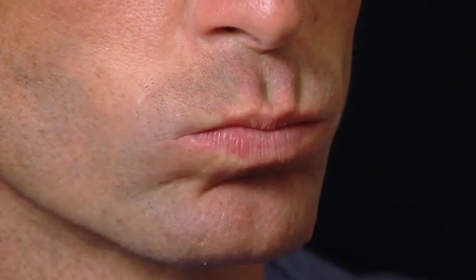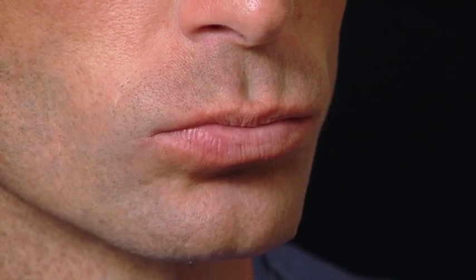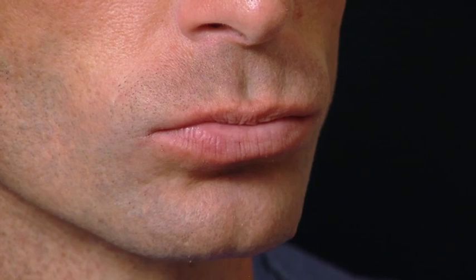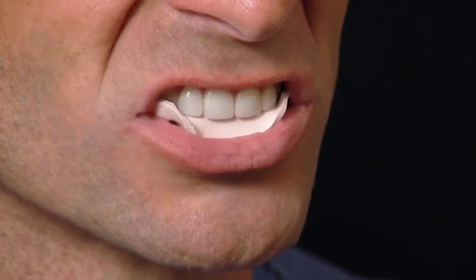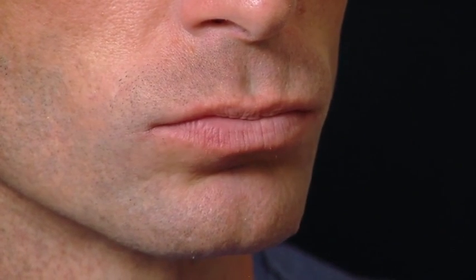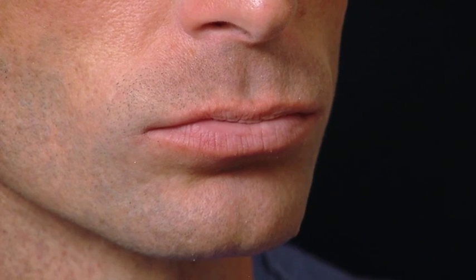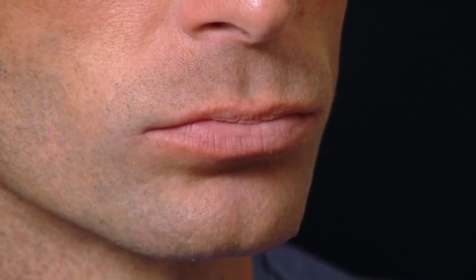Insert the aligner into your mouth. Pull your lower jaw back to engage your lower teeth into the indentations on the bottom of the tray. Once your lower jaw is in the correct position, squeeze or bite on the tray as if to put your back teeth together. Repeat the process until your natural bite position is achieved. This may take anywhere from 5 to 10 minutes. Contact your prescriber if you have trouble with your bite.